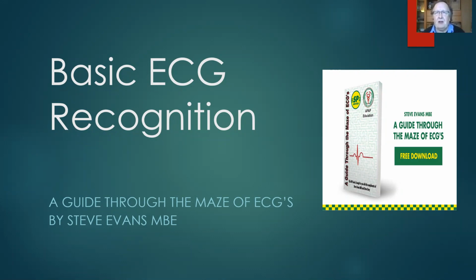All of these are parts of the jigsaw that will help you understand what you're dealing with. So we're going to put ECGs in that little box there. So for us, it's just one tool in a bigger toolbox.